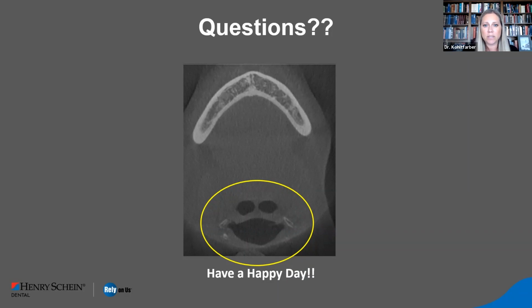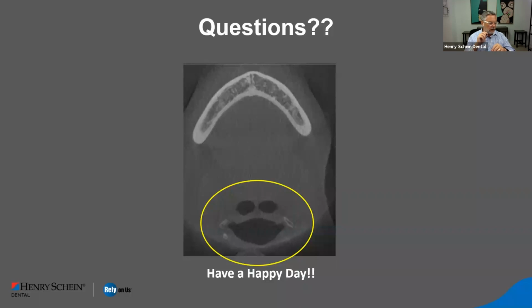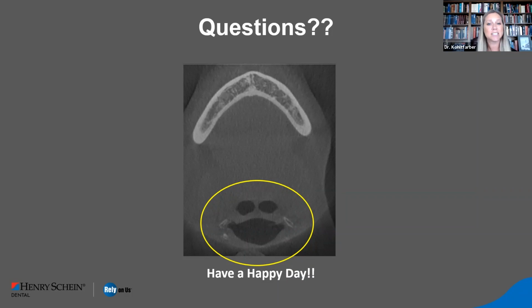And definitely if you're placing a sinus lift, bone graft, anything like that, you need to take a CBCT right before you're ready for that implant placement. Give it the longest amount of time to integrate properly, and then you want to be able to evaluate what you actually have. So, do you recommend a CBCT right after placing the bone graft, or wait till it integrates? We see people doing that many times.